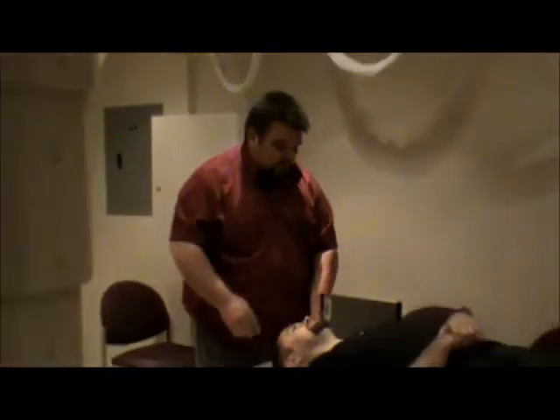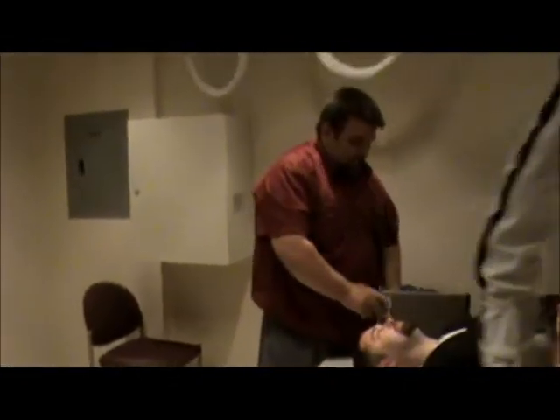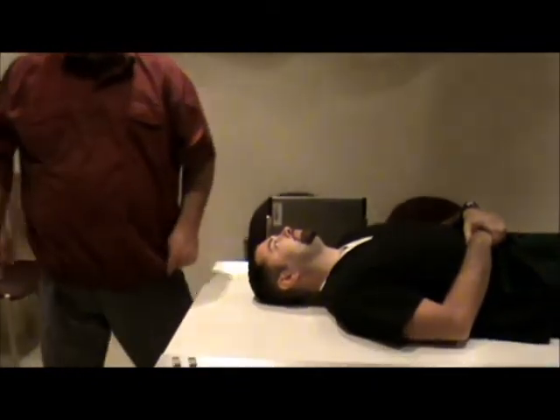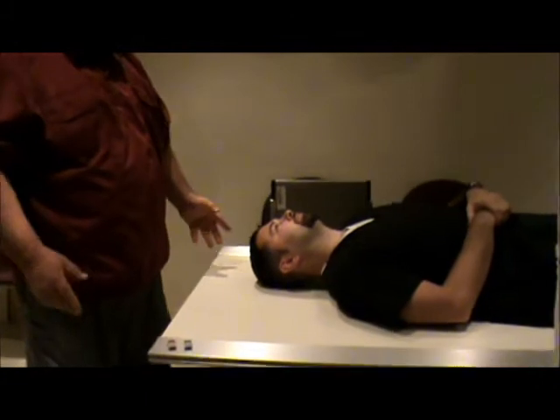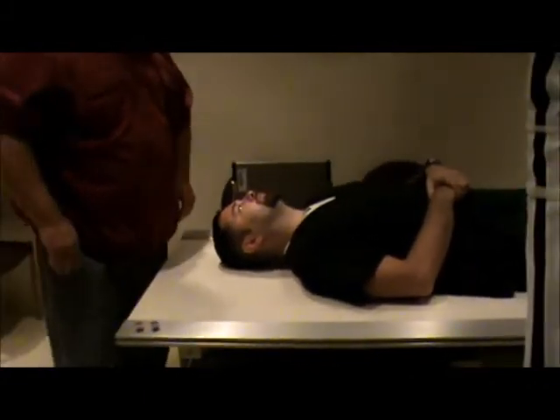We're going to have the patient laying on the table. We're going to have a weight placed behind the film holder to keep it in place so it doesn't fall over. Our centering is going to be very similar to a regular cervical x-ray. Our SID needs to be 60 to 72 inches.